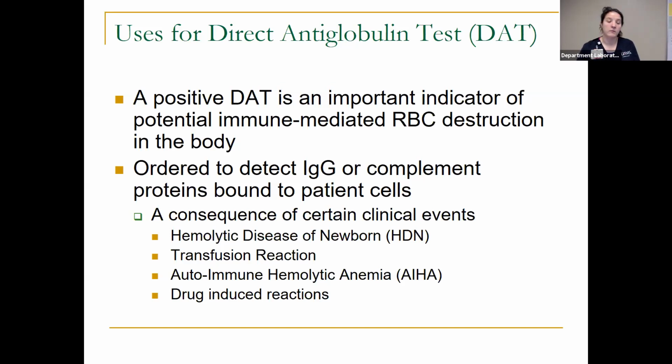How do you give somebody blood products that have autoimmune hemolytic anemia? It's very complicated. Oftentimes, if they have an autoimmune hemolytic anemia, if it's cold reacting, meaning that it's only reacting at initial spin, blood bank can recommend the use of a blood warmer to warm that unit up prior to being transfused. If it's a warm reacting antibody, we are not going to be able to give completely compatible units of blood.